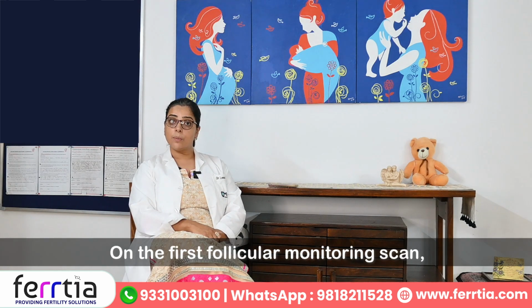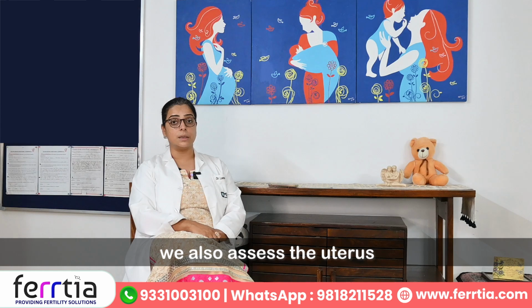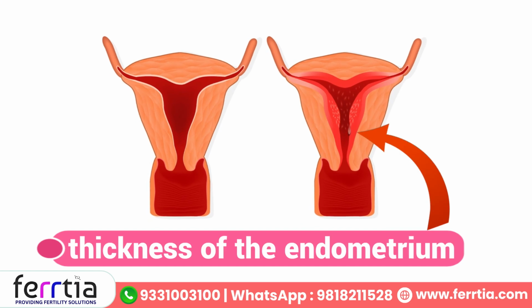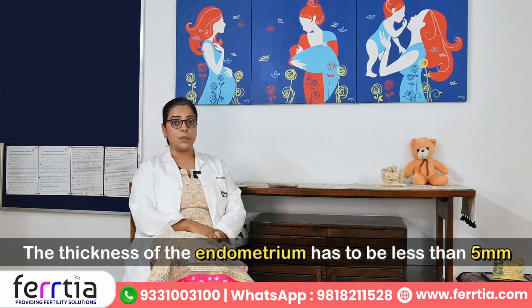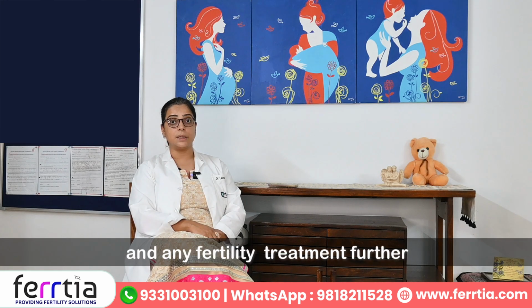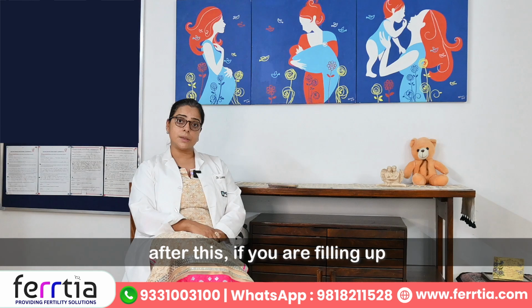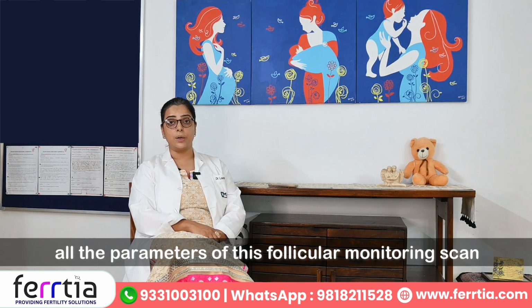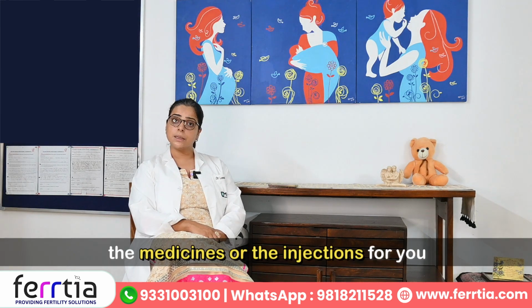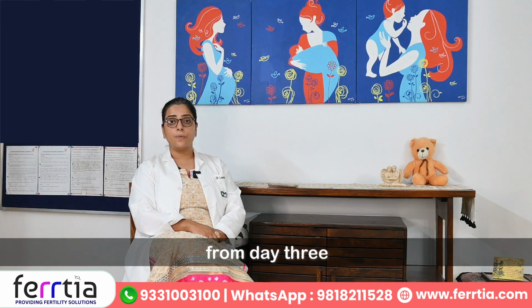On the first follicular monitoring scan, we also assess the uterus. When we assess the uterus, we see the position of the uterus. We also see the thickness of the endometrium. The thickness of the endometrium has to be less than 5 mm when we start a follicular monitoring cycle and any fertility treatment further. After this, if you are fulfilling all the parameters of this follicular monitoring scan on day 2 or day 3, the doctor starts the medicines or the injections for you from day 3.